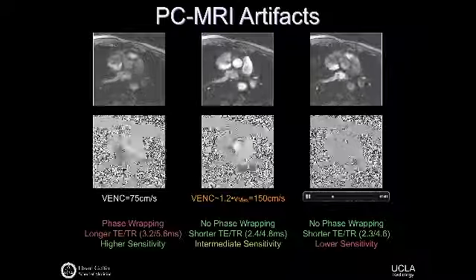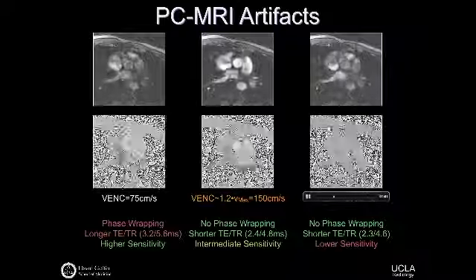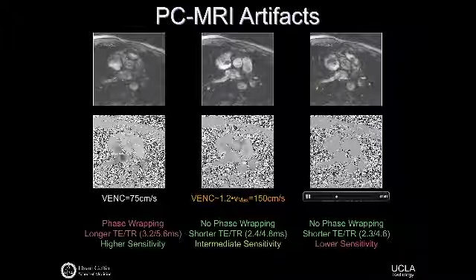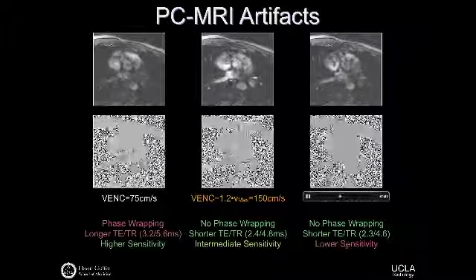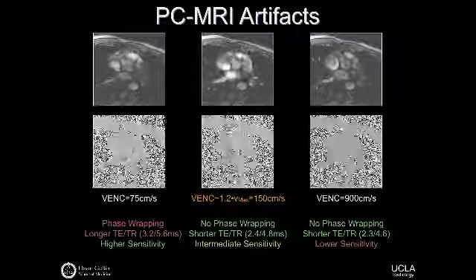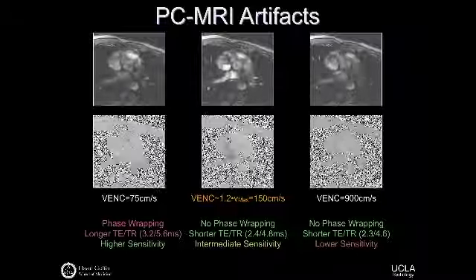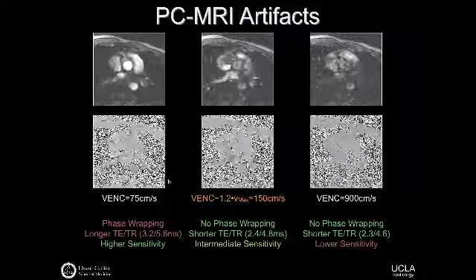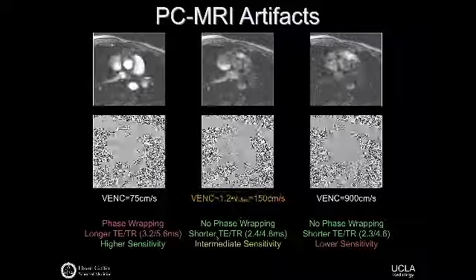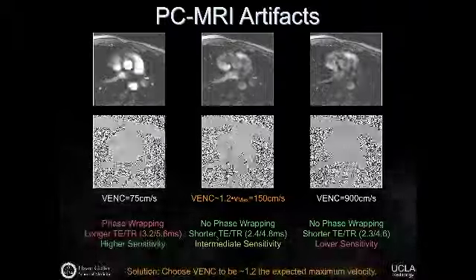If you look at the aorta again here, the phase signal's barely changing. It looks pretty much the same through the whole cardiac cycle. And so you won't have phase wrapping, but you'll have no sensitivity. So the point is that to get good PCMRI measurements and be able to measure velocities accurately, you have to choose your VENC appropriately for sensitivity and to not have phase wrapping.